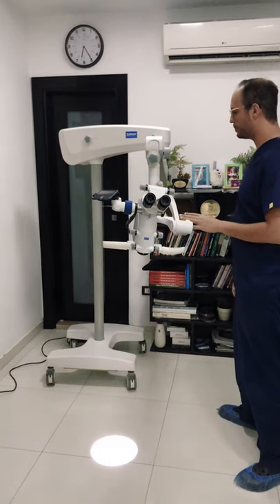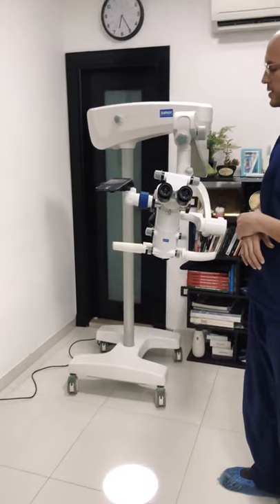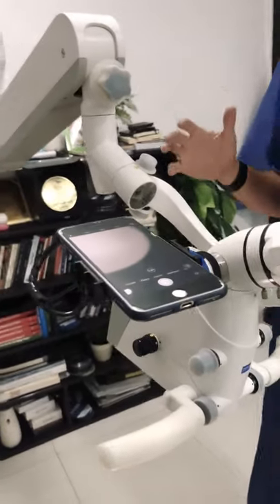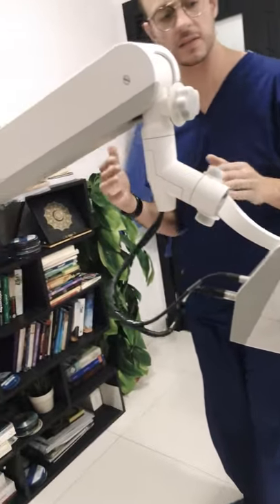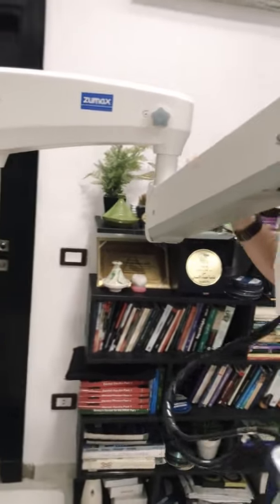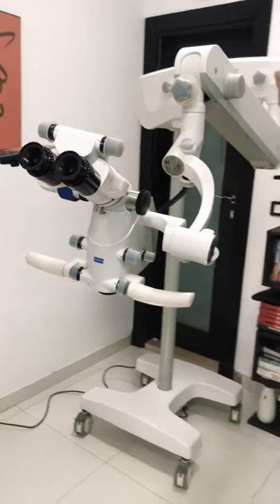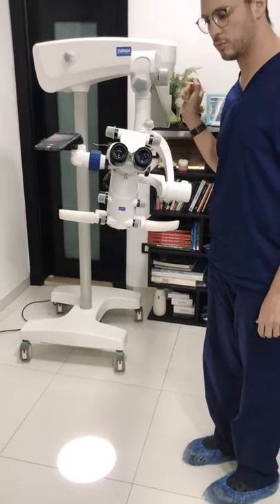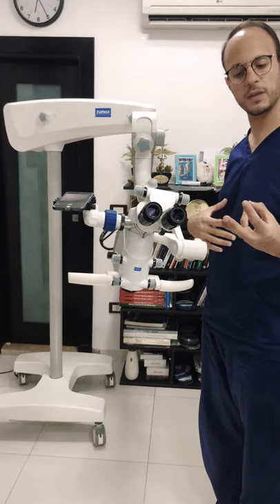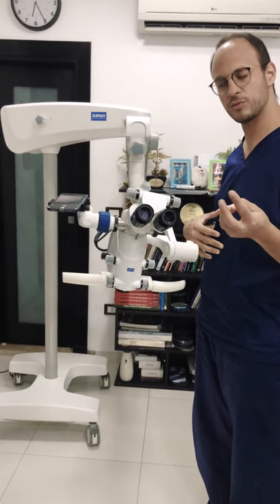The third microscope being reviewed today is the Zoomax — in the upper-middle range line. They have one microscope which provides an extra feature as their highest range model: the OMS2380. This is an update of what they had before, the OMS2350 and then the OMS2360.